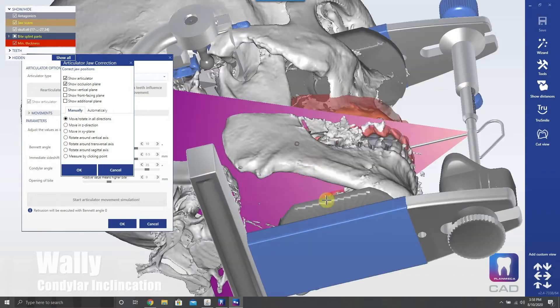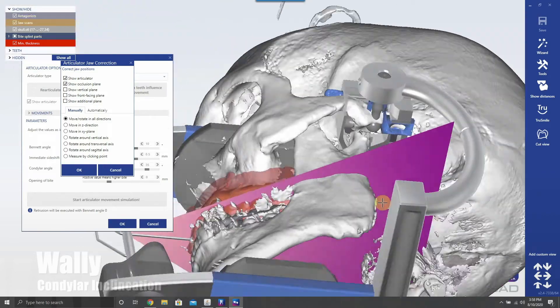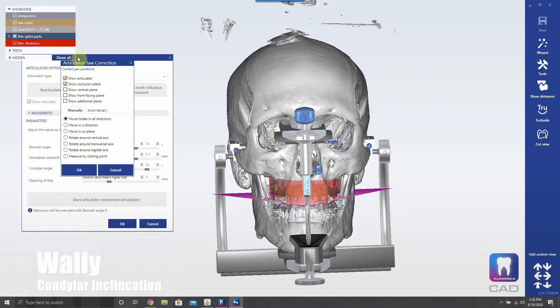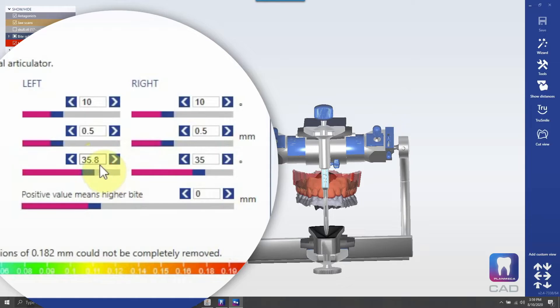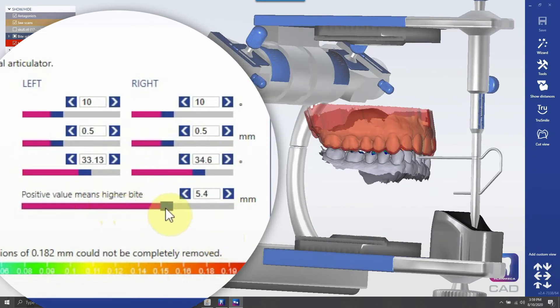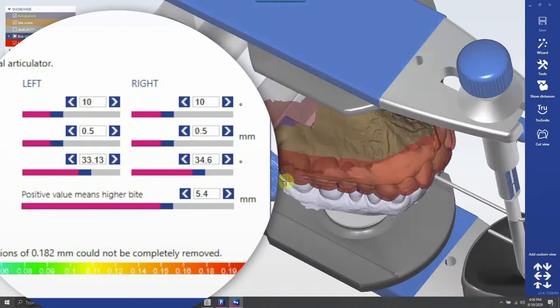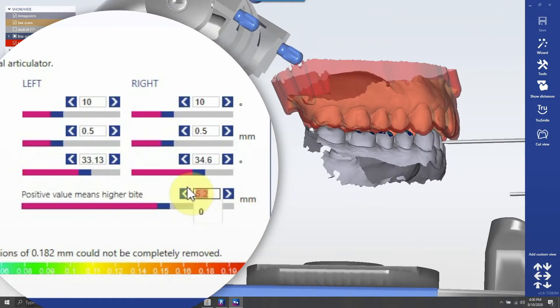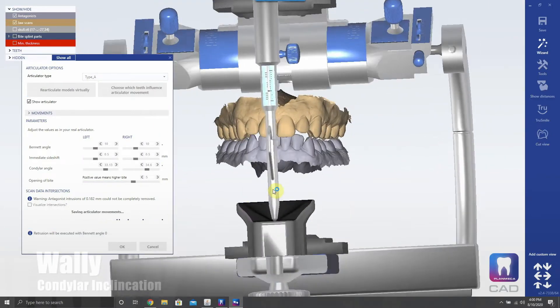We are adjusting here based on this patient's specific anatomy and spending time to get a good mounting. Now we're going to adjust the condylar inclination to the patient's specific numbers — and it does actually dramatically change things. We're going to open the vertical dimension and open the pin up to make room for the occlusal guard that we're going to be 3D printing out of Keystone Soft, going through the guidance movements.